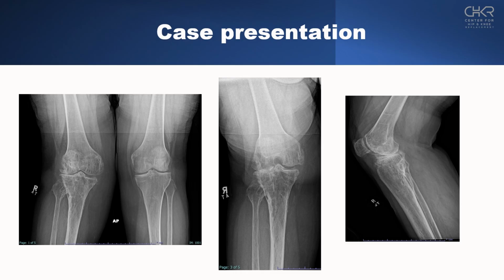So in this older individual, a patient has a post-traumatic arthritis following prior open reduction and internal fixation of this tibial plateau fracture. The patient had a plate which has been subsequently removed. And although the plate stabilized the initial fracture, there is residual deformity with depression of the lateral tibial plateau, you can see here, and alteration of the tibial slope.